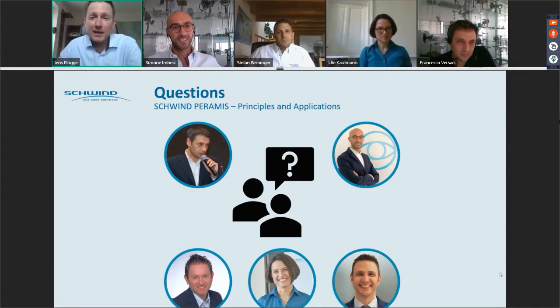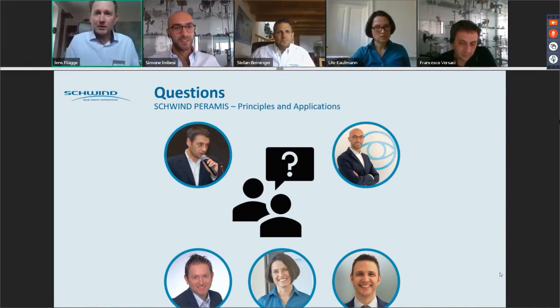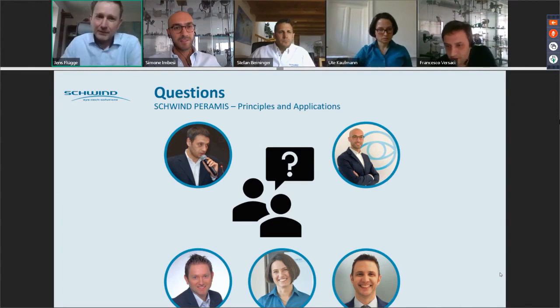In case the eyelid is in the way, the SCC is probably not functioning very well. So what I always do in the introduction phase is that before you click the measurement, you blink, you open both eyes wide, and then you capture the image. That usually should already do a good job for capturing the SCC.